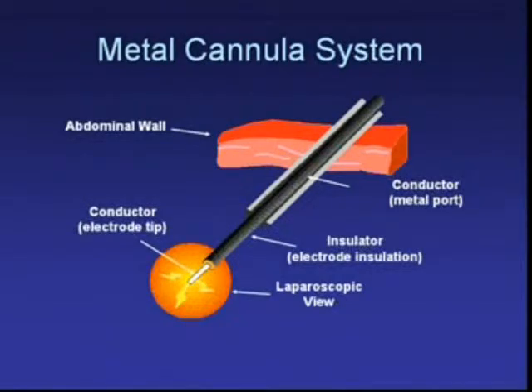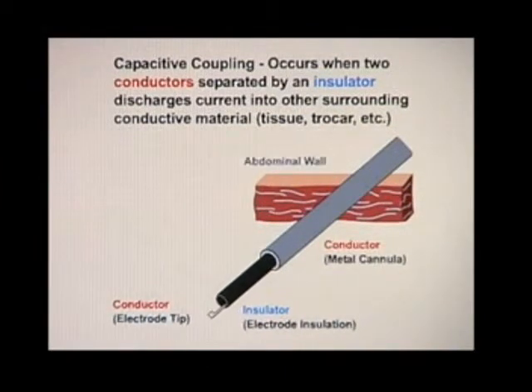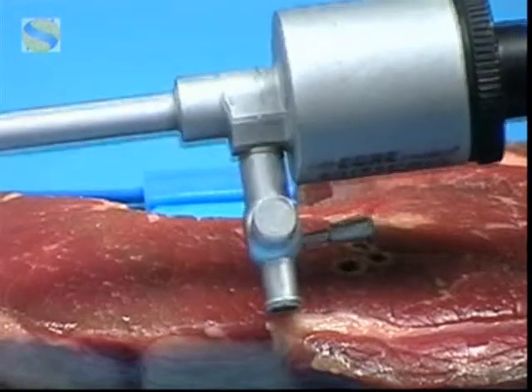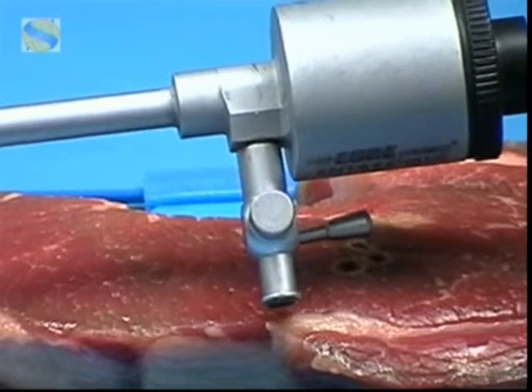Consider this setup using a metal port. Here we have a conductive active electrode surrounded by non-conductive insulation, in turn surrounded by a conductive metal port. As you can see, we create a capacitor with this combination, but this combination is quite safe. Although the port becomes charged each time the electrosurgical instrument is activated, the energy is readily dissipated safely since the port is in direct contact with the abdominal wall. In this video clip, you can see the capacitive current discharging from the port onto the tissue. This is the energy that usually dissipates over the abdominal wall.